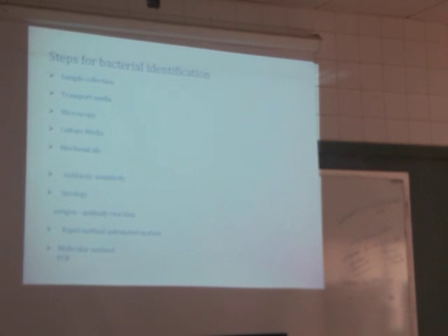You see here a number of antibiotics. This is penicillin. This is the nitrofuran antibiotic. This is vancomycin. From each of them, one disc is removed and put here. The next morning he sees the result.